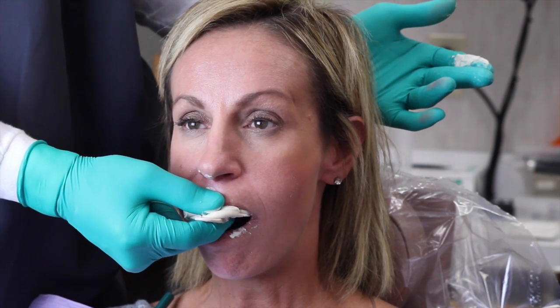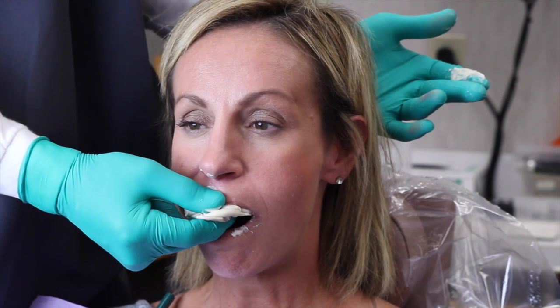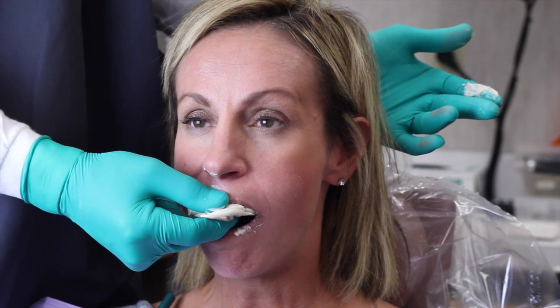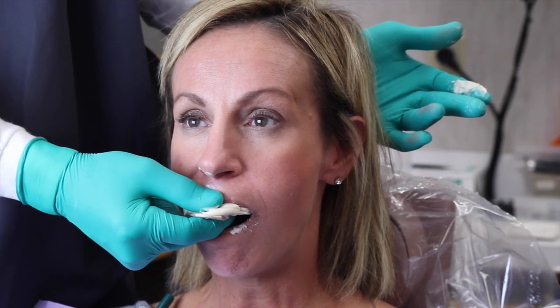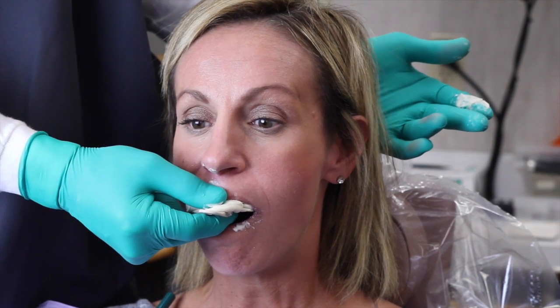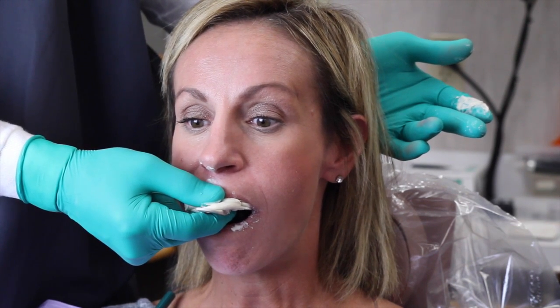For those patients who are even more severe gaggers, as strange as it might sound, what we found that's very helpful is to actually have them raise one of their legs. We'll have them straighten their knee and then raise their right or left leg off of the chair. And that distraction seems to be very, very effective. We do a lot of impressions, a lot of alginates, and we have never had a patient that we couldn't overcome with the combination of those two procedures.